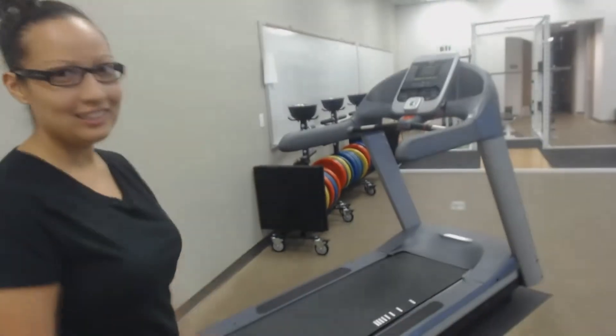Hi, today we're doing the Bruce Treadmill test. This test is to monitor the development of the subject's general endurance, also known as VO2 max. This test is suitable for active or sedentary individuals, but not for those who have contraindications. The requirements for this test are the treadmill, which is right here, the heart rate monitor, and an instructor to instruct the person.